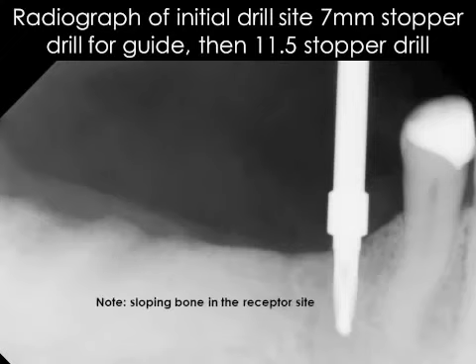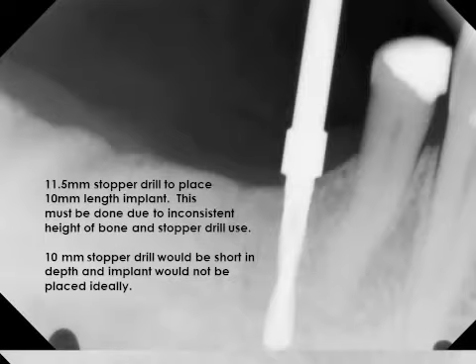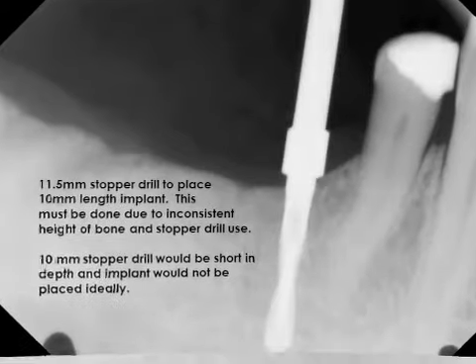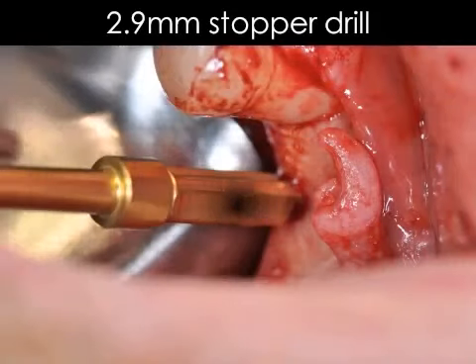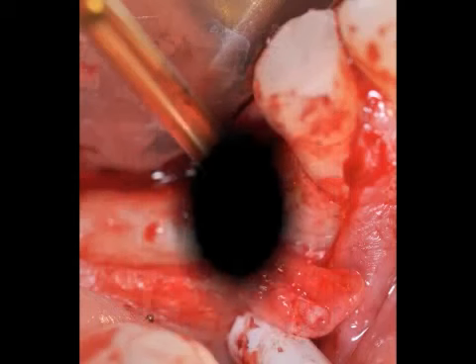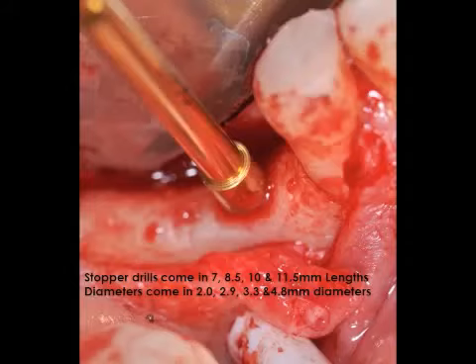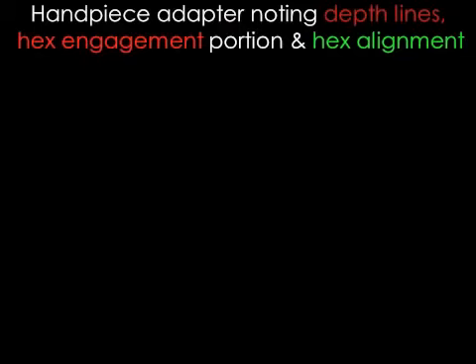However, you can note the bone in this particular area sloping upwards, and you can see where the stopper drill is not fully seating. So therefore we had to over prepare the osteotomy and utilize the 11.5 stopper drill to place a 10 millimeter implant to the proper depth that it needs to be. Next, you'll see the 2.9 stopper drill, again utilizing the 11.5 length, which again, we're only going to be placing the 10 millimeter length implant. But due to the sloping bone, we needed to use an 11.5 drill so that your implant platform will be at proper depth. Stopper drills do come in 7, 8.5, 10, and 11.5 lengths, and they do come in each diameter, which is very nice for the end user.